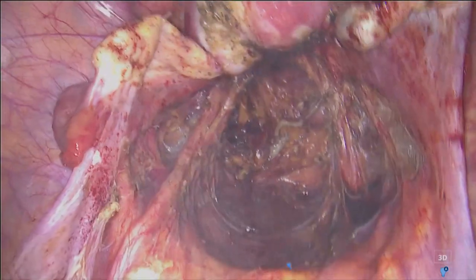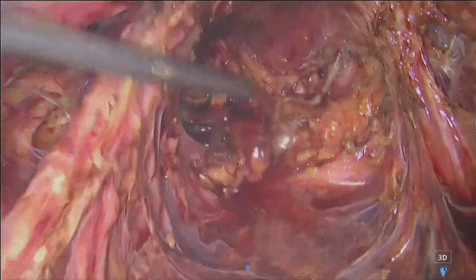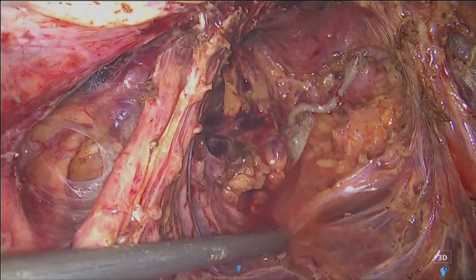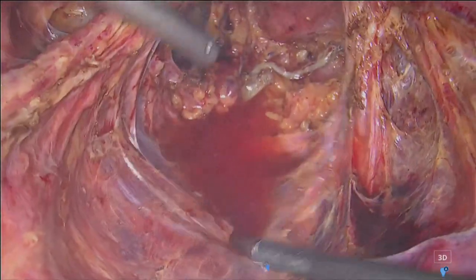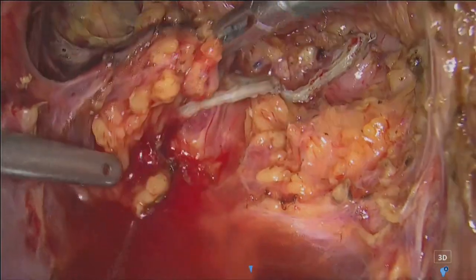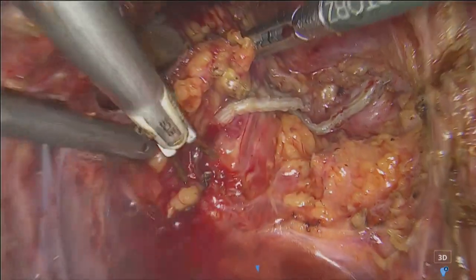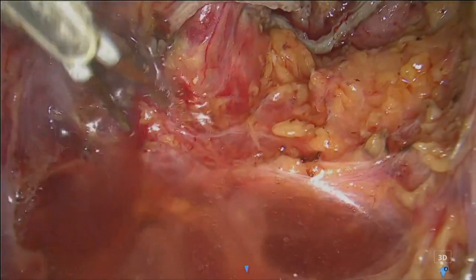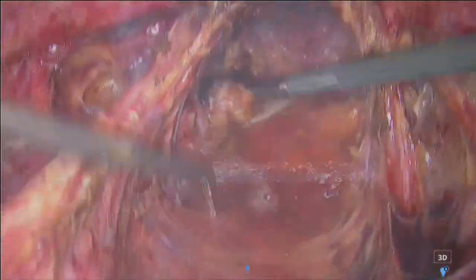We are ready now with circular stapler for the last part of the surgery, and then we have only to remove the retrocervical nodule. Okay, and to check the perfusion, the vascularization that we usually do by indocyanine green evaluation with the Rubina camera that we are using. We are using the 3D 4K Rubina camera, with the possibility to see the vision for indocyanine green evaluation. Okay.